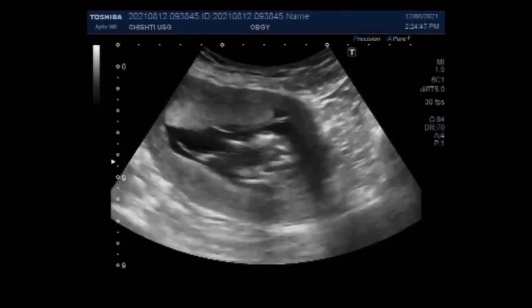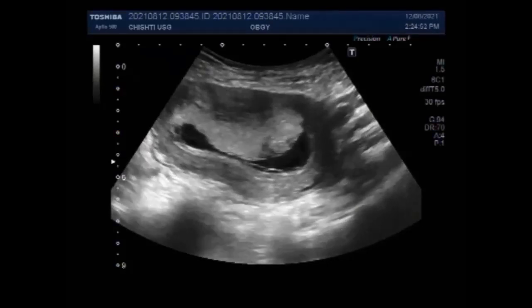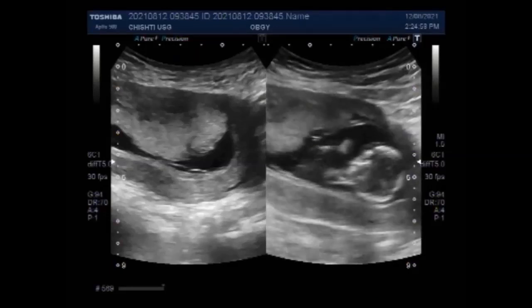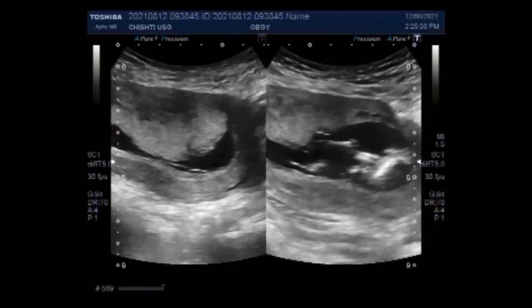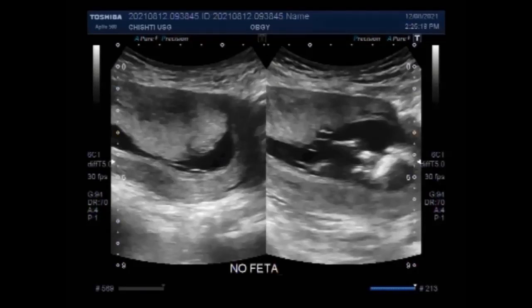The most common cause of first trimester spontaneous abortion is fetal chromosomal abnormalities. While most practitioners wait until at least 6 weeks to perform the first ultrasound, the gestation sac can be seen as early as 4.5 weeks after the last period. Heartbeat can be detected as early as 5 to 6 weeks, though it might not be possible in all the cases. But this is a pregnancy of 14 weeks, where fetal cardiac activity must be seen.